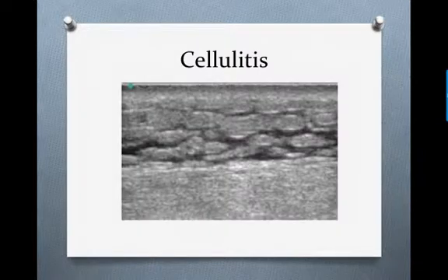This is the appearance of cellulitis on ultrasound. This is called cobblestoning, and as you can see, there's no discrete fluid collection present.